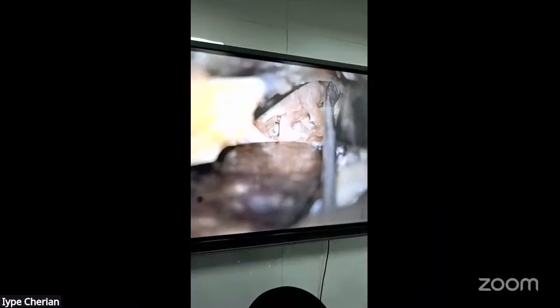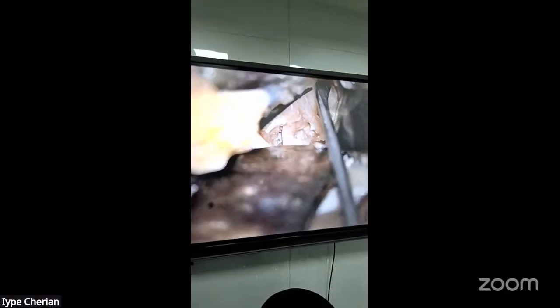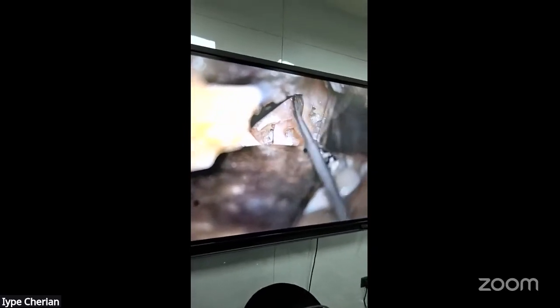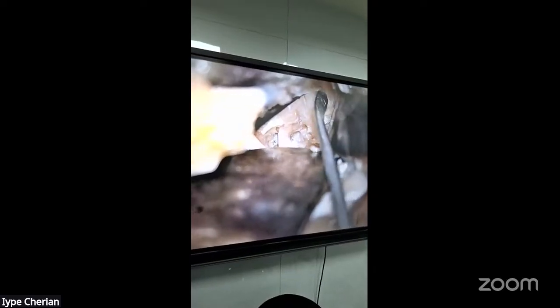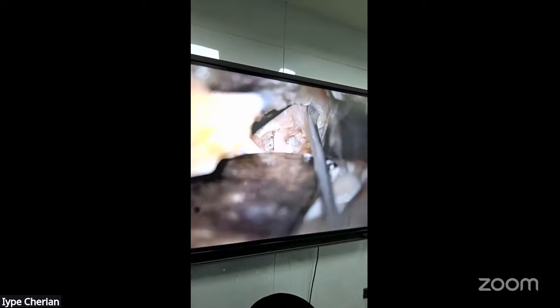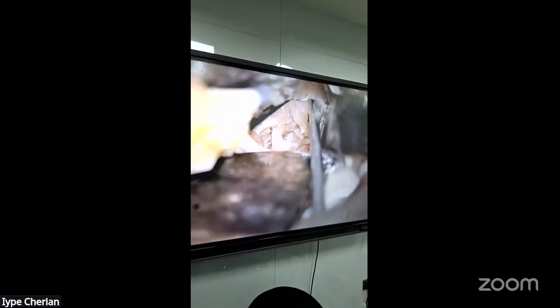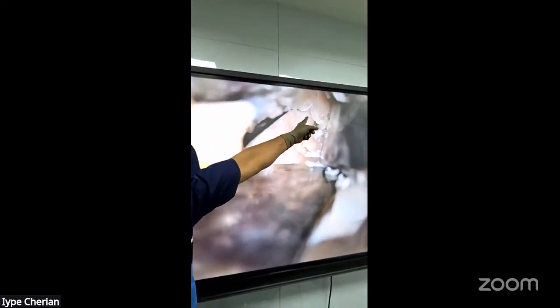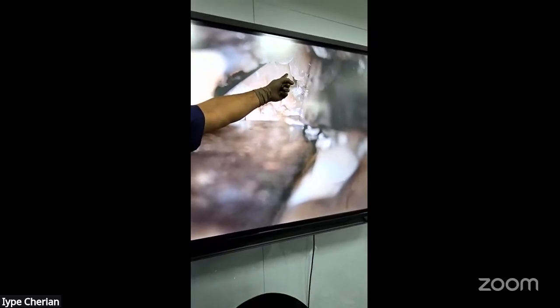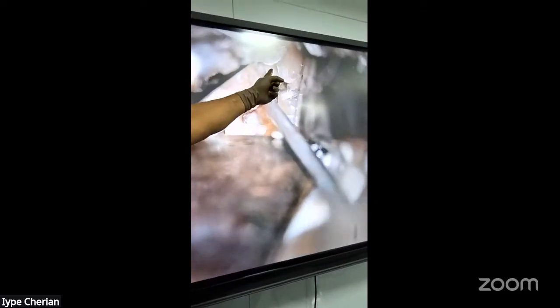So now I'm going ahead and demonstrating. I'm going to cut the dura above the. You can nicely see the sixth nerve here. Can you lift it, Cheryl, for 1 minute? Yes, I'm going to. Just lift it. Yes. That is the sixth nerve.